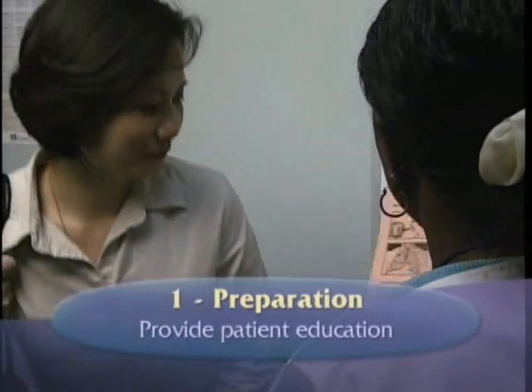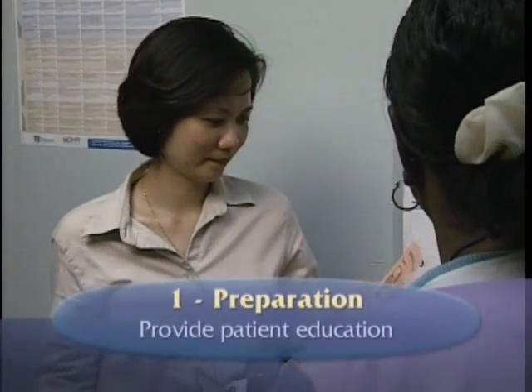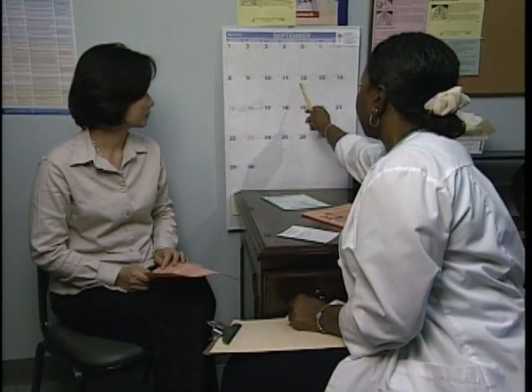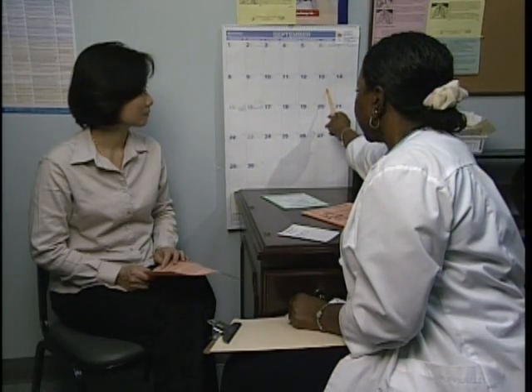After collecting supplies, the next step is patient education. You should sit so that you are both comfortable and facing each other. Discuss why the skin test is given, what is involved in the procedure, and when the patient should return for the test to be read. Explain that 48 to 72 hours after the test is administered, the patient must return to have the induration measured and evaluated. Make an appointment for the patient to return.